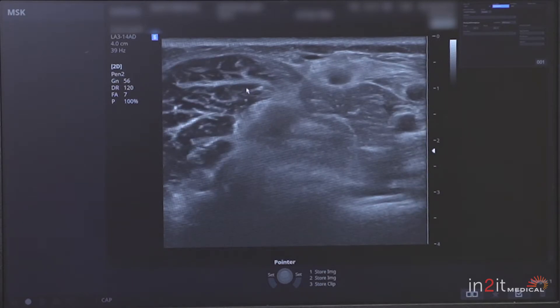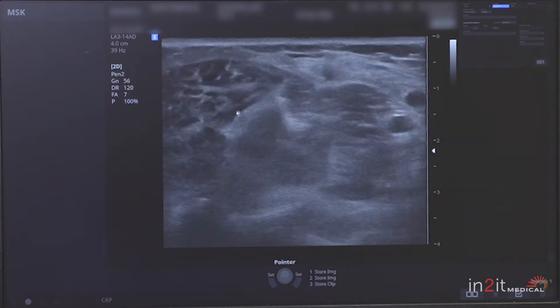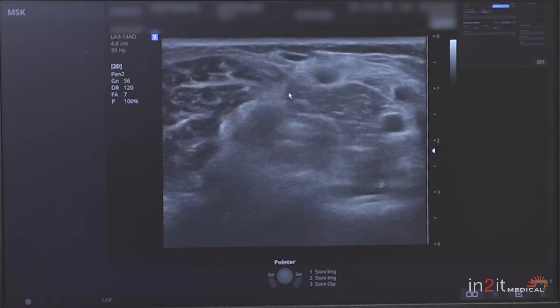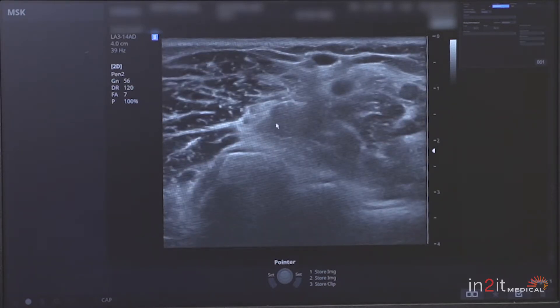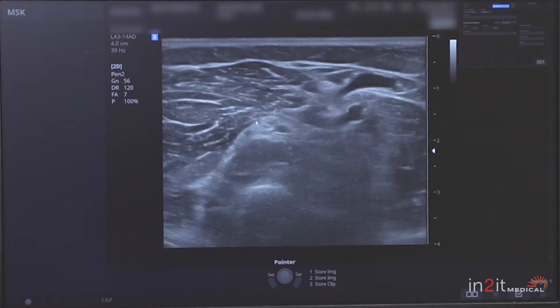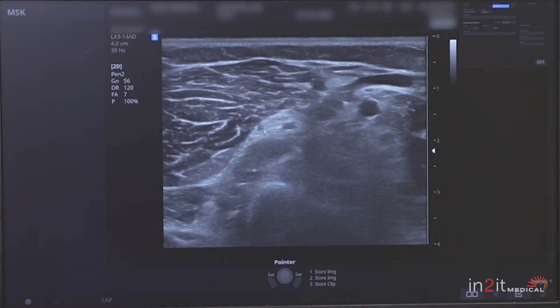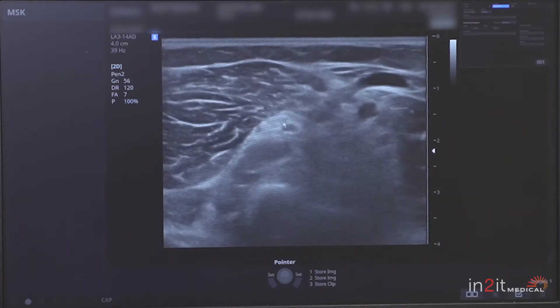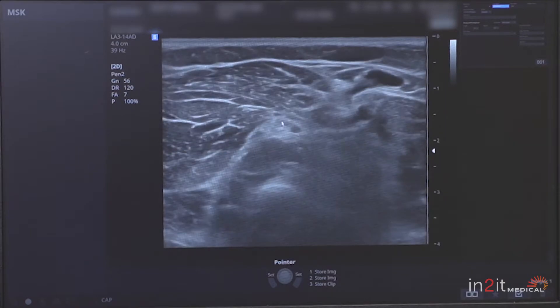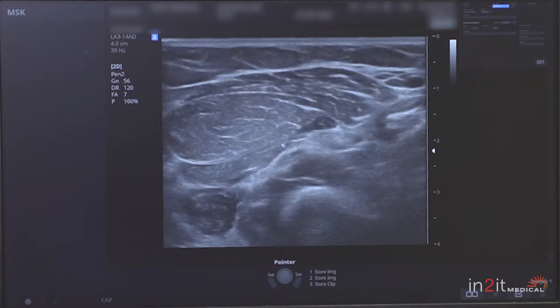What I'm looking at here now is a couple of muscles — this is brachialis here, brachioradialis here — and in between the two I see another nerve. It's very bright, very white, I can see it readily here. This is called the radial nerve. If I follow that radial nerve down I see a little artery sweep underneath it, and then I see a nerve here and a nerve here. If you watch closely you'll see them bifurcate or split apart. This represents the superficial branch of the radial nerve and the deep branch of the radial nerve.